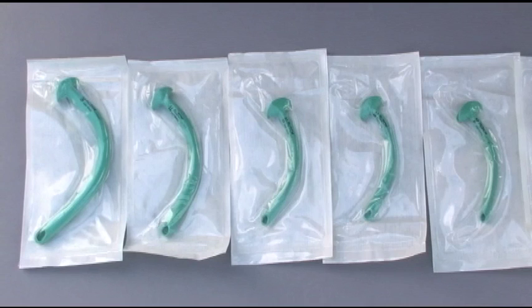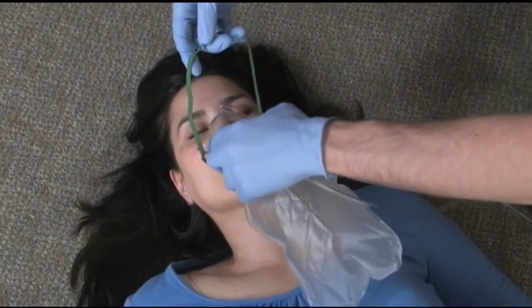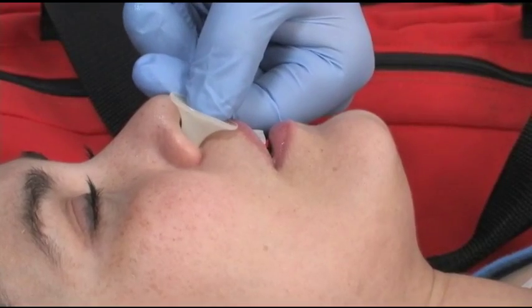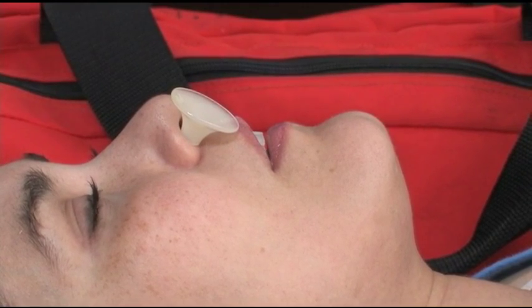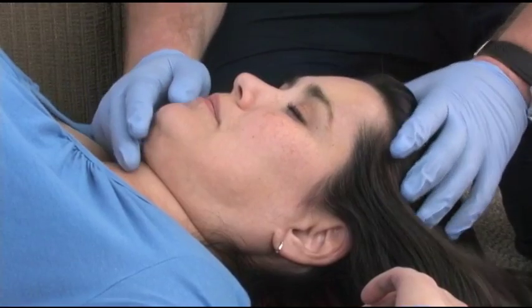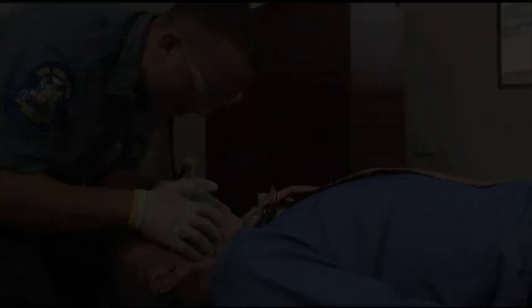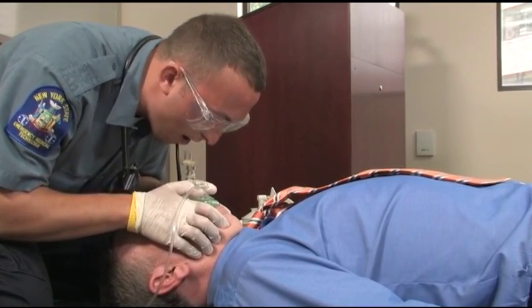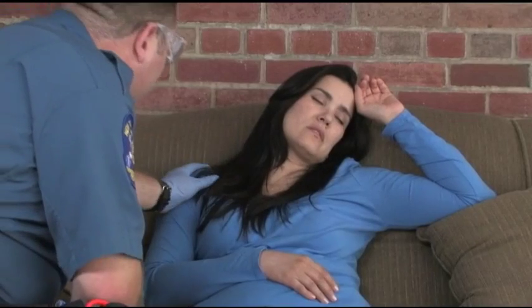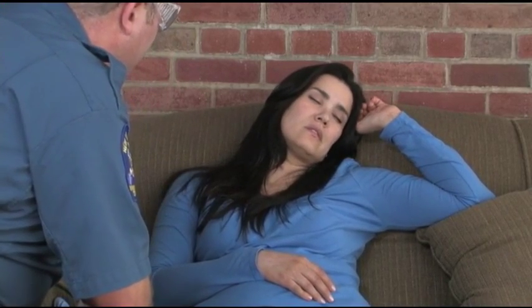The nasopharyngeal airway, more commonly called the nasal airway or NPA, is a disposable, uncuffed plastic or soft rubber tube used to maintain a patent airway in a patient with a gag reflex. The nasal airway is considered an airway adjunct because it must be used in conjunction with manual airway maneuvers such as the head tilt chin lift. The nasal airway may be used in conjunction with an oxygen mask or bag valve mask. It is strongly suggested in any patient who requires assisted ventilation but still has a gag reflex.